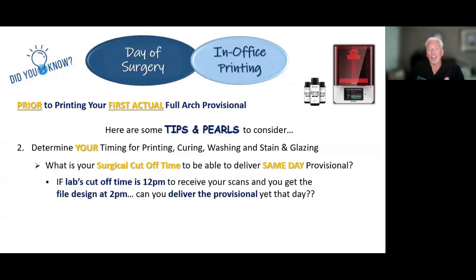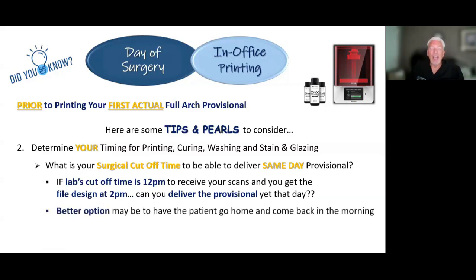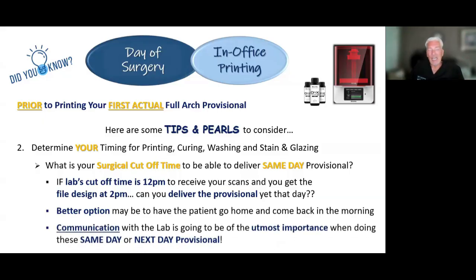So we kind of talked about this. Just things to work out. And maybe for you, if you're going to do your own print in office, just take the pressure off, let the patient go home, come in the next morning, and you have all the afternoon or evening or whatever to get that for the patient. So something else to think about. But once again, talk to the lab, talk to people.